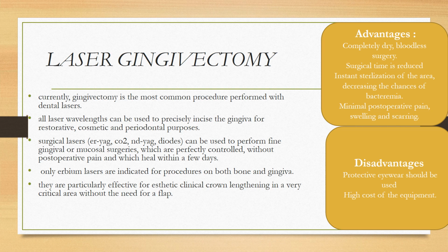All of these can be used to perform gingival or mucosal surgeries, which are perfectly controlled without postoperative pain and which heal within a few days. Only erbium lasers are indicated for procedures on bone and gingiva. They are particularly effective for aesthetic crown lengthening in a very critical area without the need of a flap. So that is the laser gingivectomy.